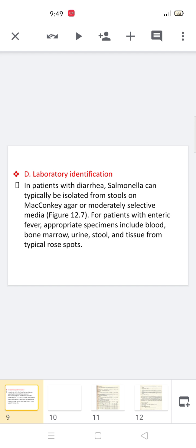There are two types of antigenic prepared kits with us, H antigen and O antigen. One point for your memory: remember this test is positive in the second or third week of the salmonella infection. So in the first week, serologically, we cannot confirm typhoid fever.